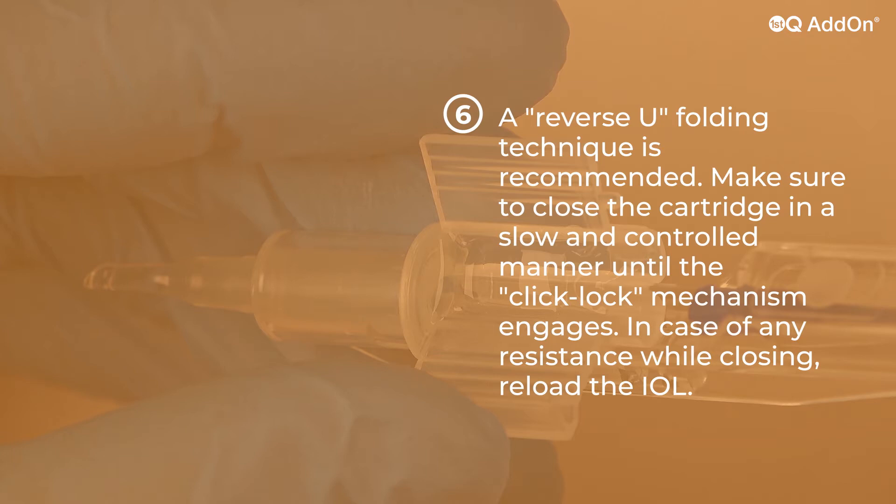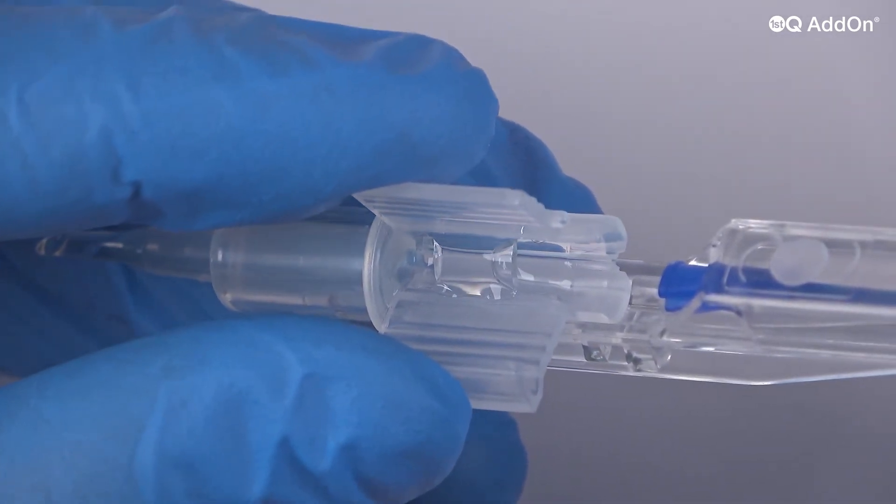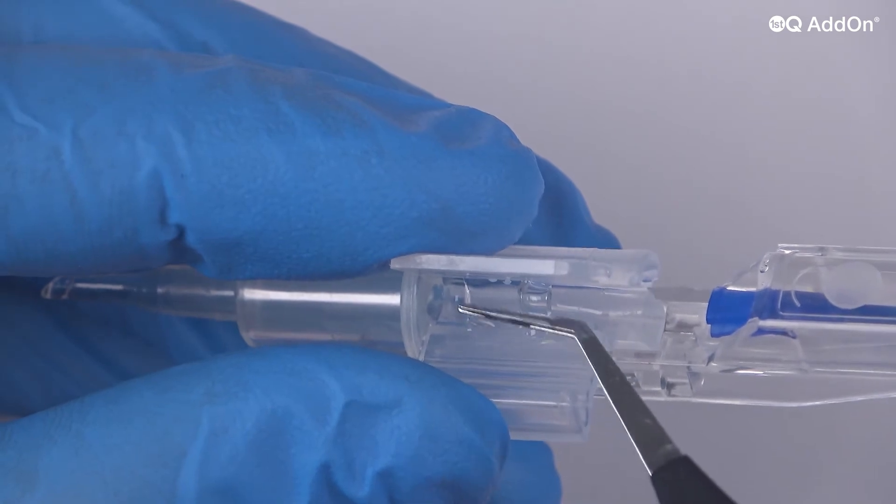Make sure to close the cartridge in a slow and controlled manner until the click-lock mechanism engages. In case of any resistance while closing, reload the IOL.